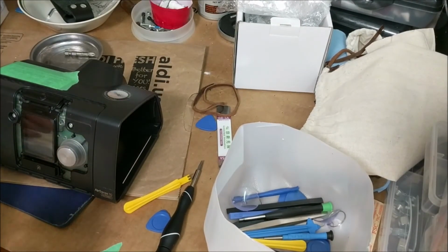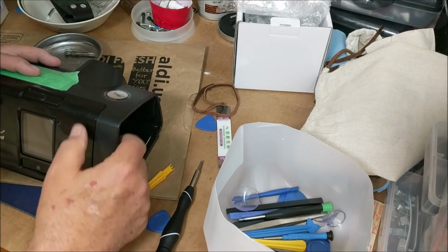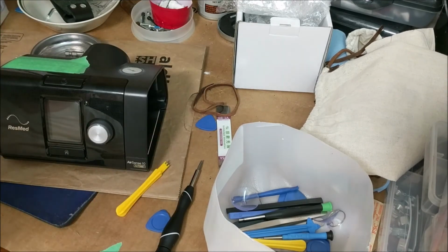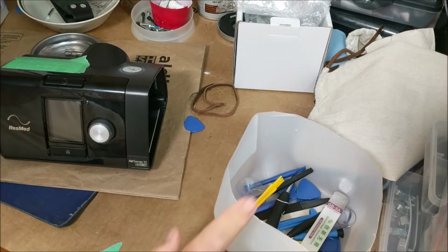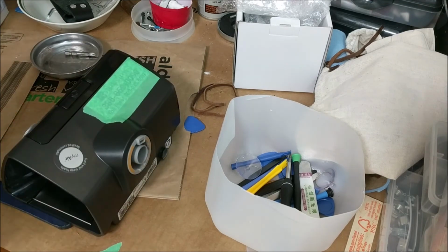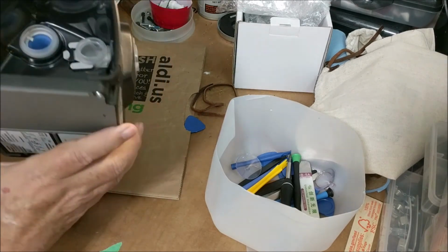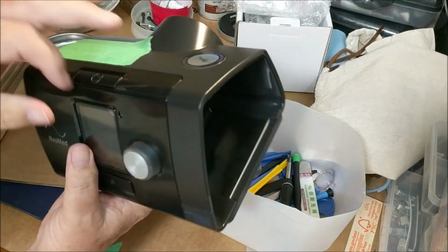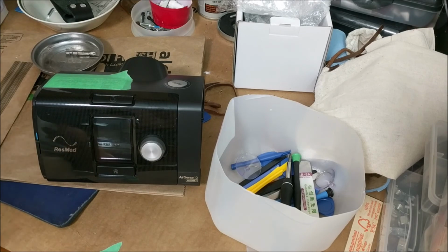Okay. All done. So, if you were hesitant, guy was hesitant. It was the 2 screws that are hidden behind this. Pop that loose, take it from the top, pop it out, comes off. You saw the rest.